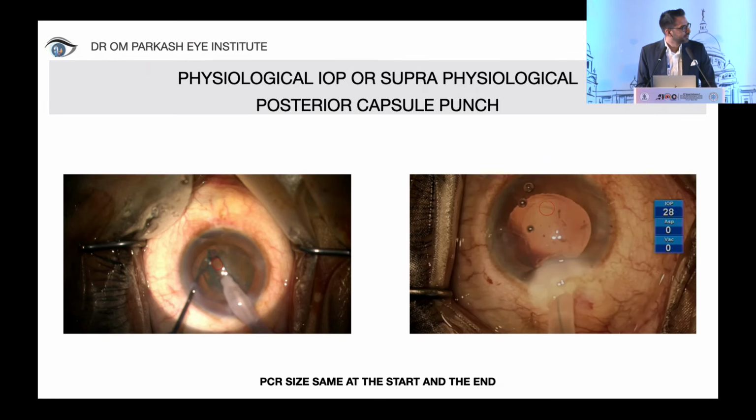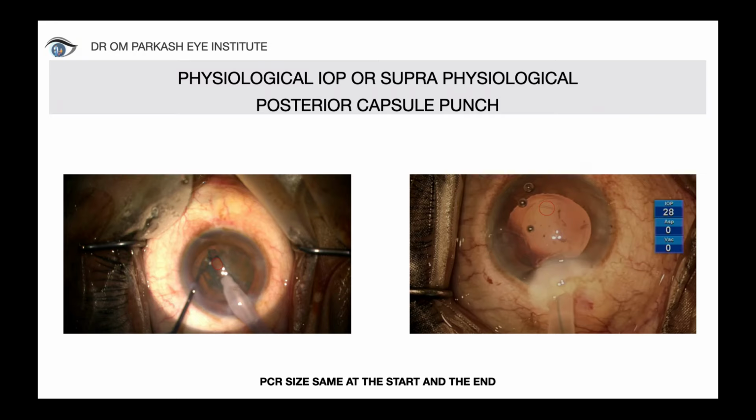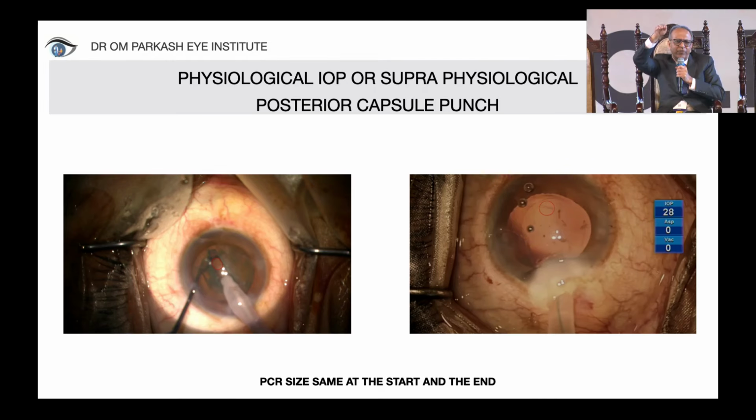If you're using bimanual, that's a much better situation, because there you are able to differentiate the level of fluid and aspiration. But by retracting, one can even retract the sleeve more to create a different plane of irrigation and aspiration.